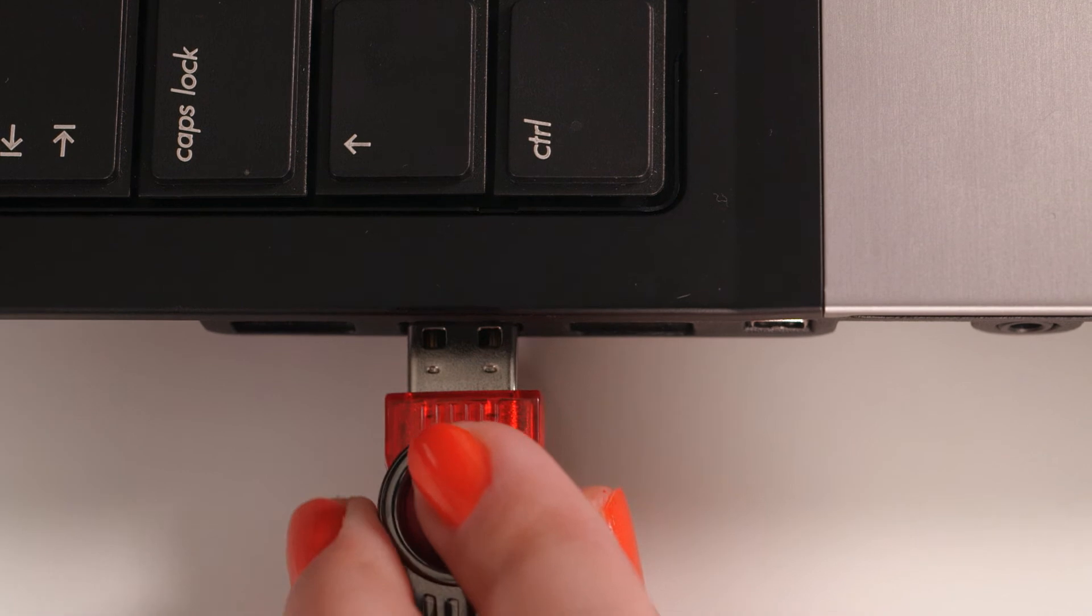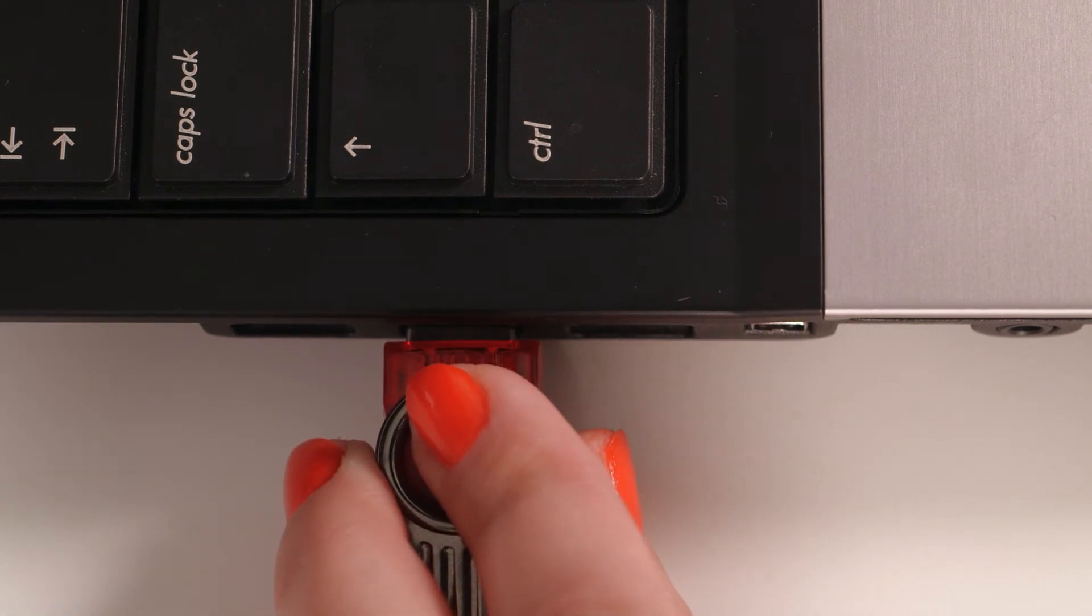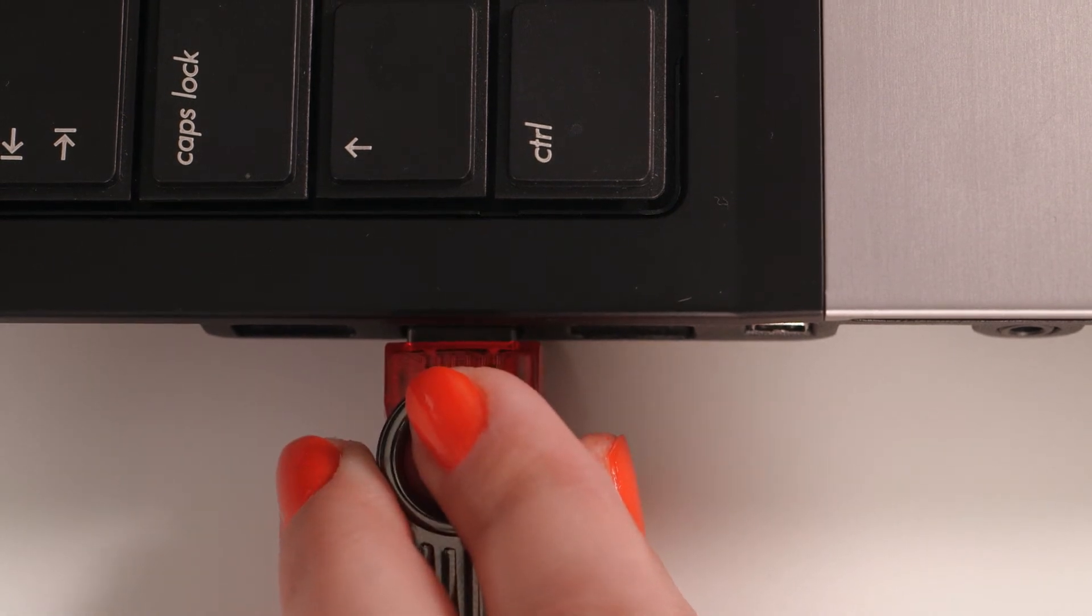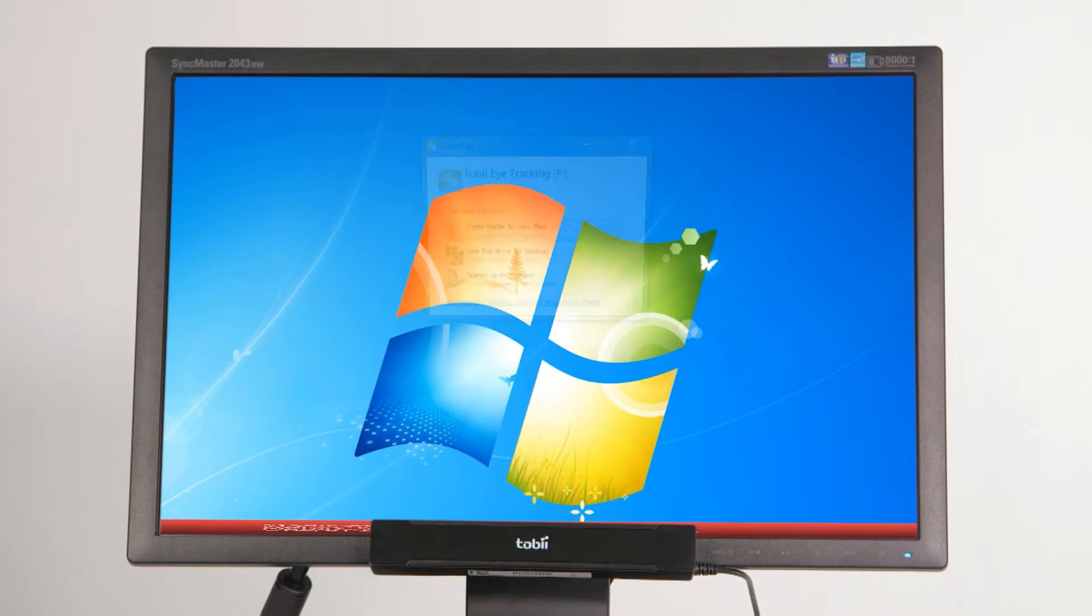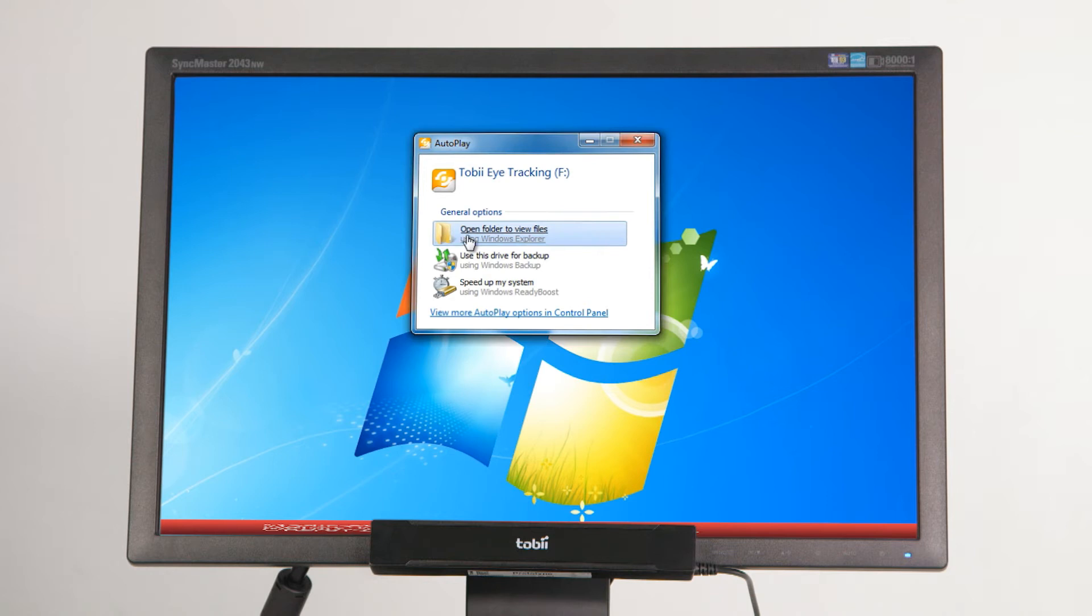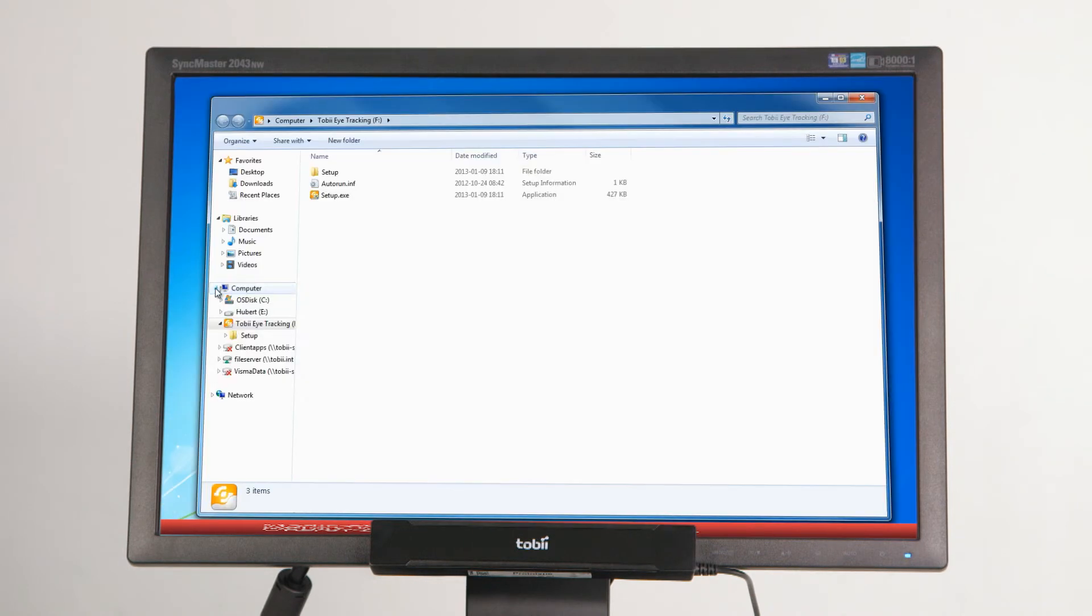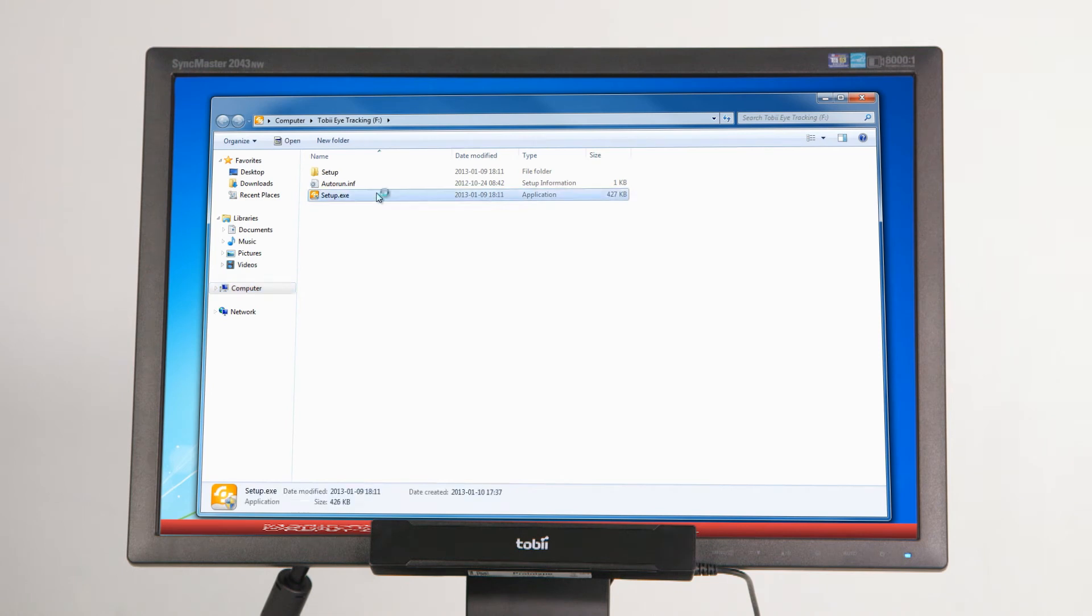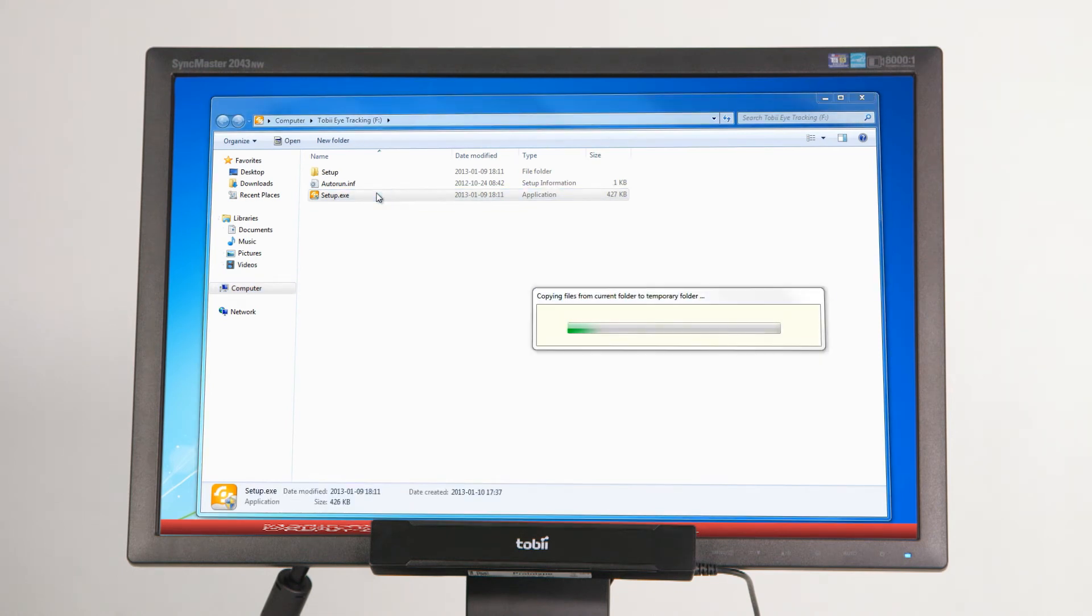Plug the USB memory stick into the computer. Once the memory stick has been detected by the system, select the option Open Folder to view files, and then double-click on the file name setup. This should launch the installation process.